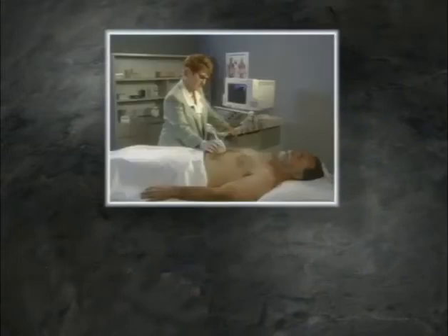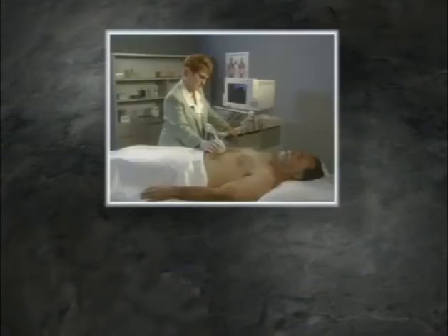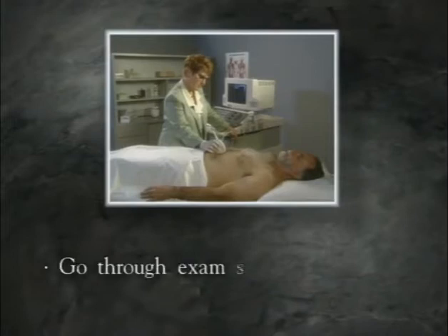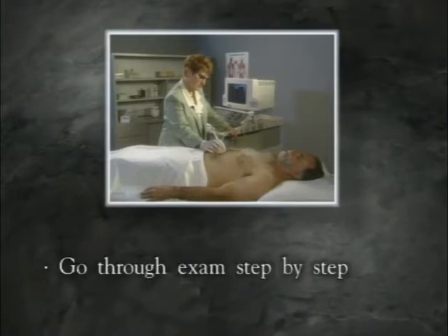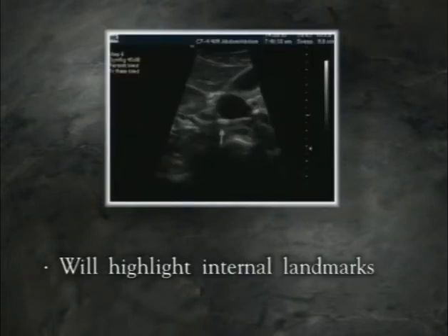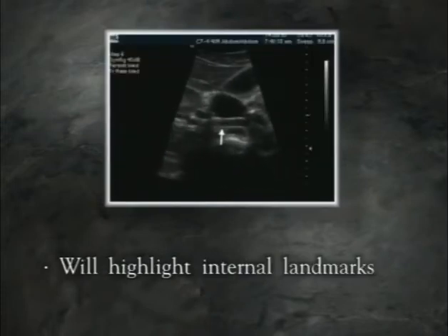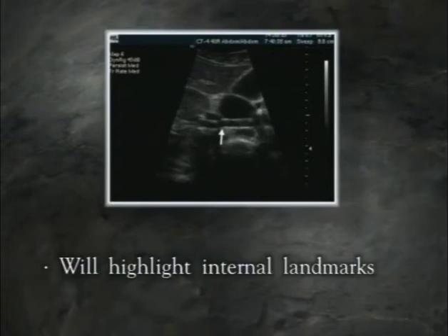After discussing the diagnostic features of each of the visceral circulatory systems, we'll be ready to go through the actual examination step by step. Internal landmarks will be highlighted to keep you, the examiner, oriented.